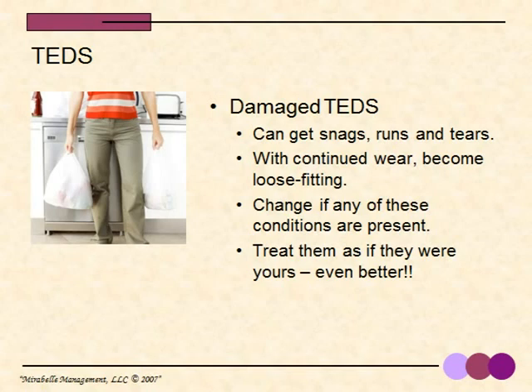You will be the eyes that sees the stocking every day, so stay alert. A resident with poor vision or arthritis will not be able to monitor their condition like you will. As I said before, these stockings are expensive, and usually the resident will have 2 to 3 pairs so he can change them when soiled or wet. Care for them as you would your own, even better. Now, here is the video showing you how to apply a pair of TED stockings.